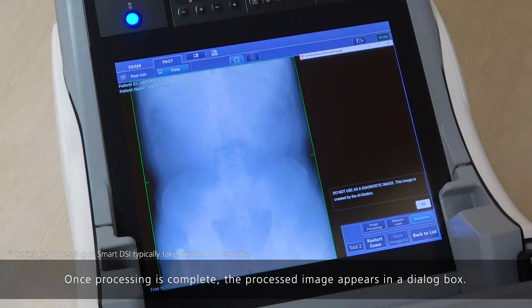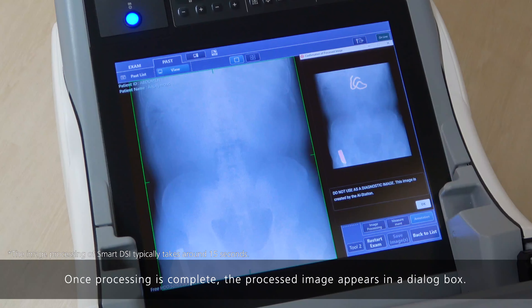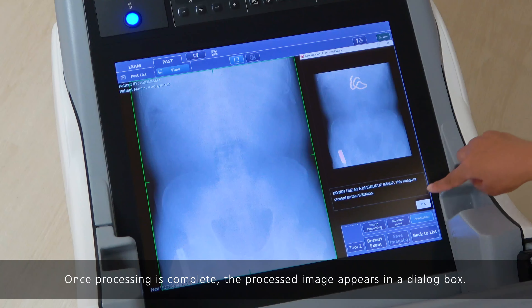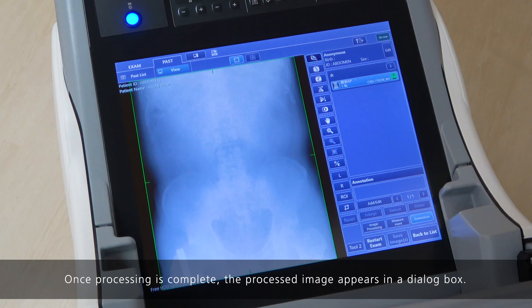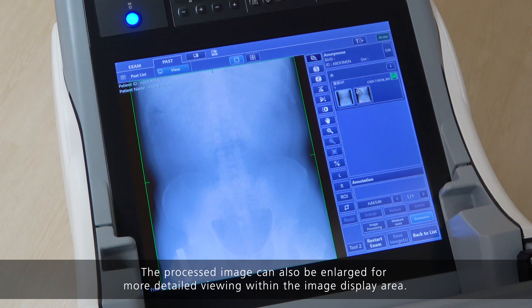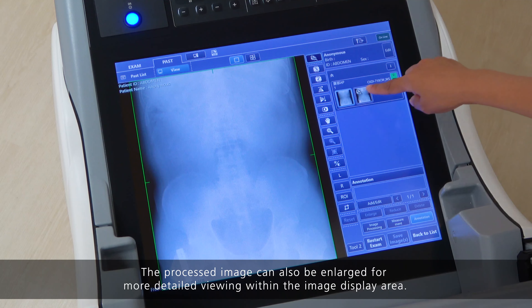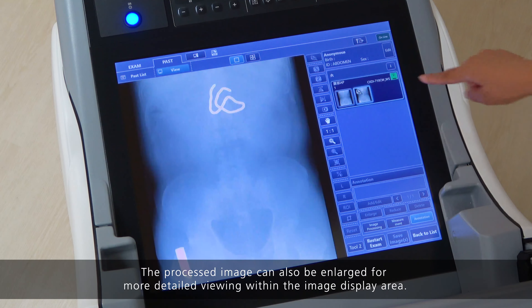Once processing is complete, the processed image appears in a dialog box. The processed image can also be enlarged for more detailed viewing within the image display area.